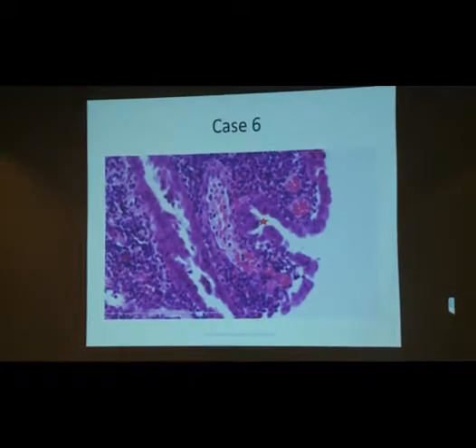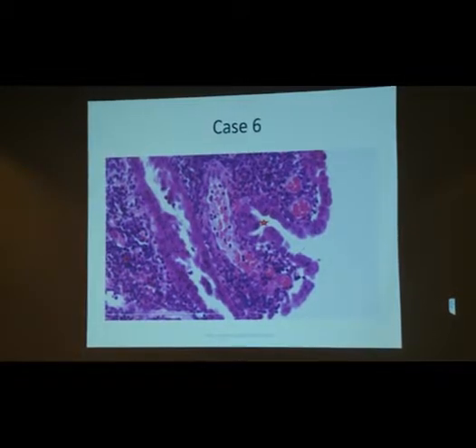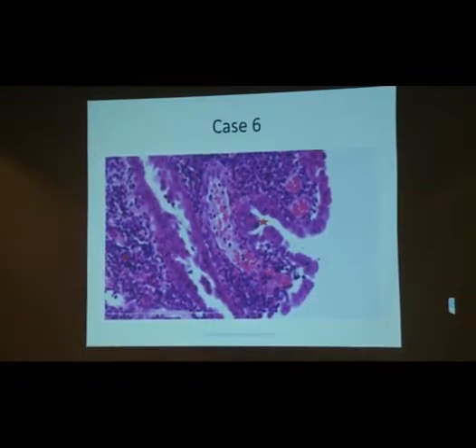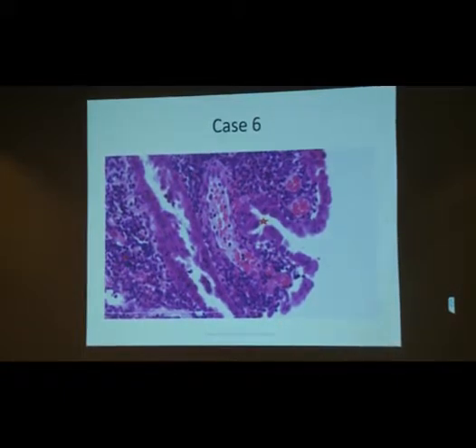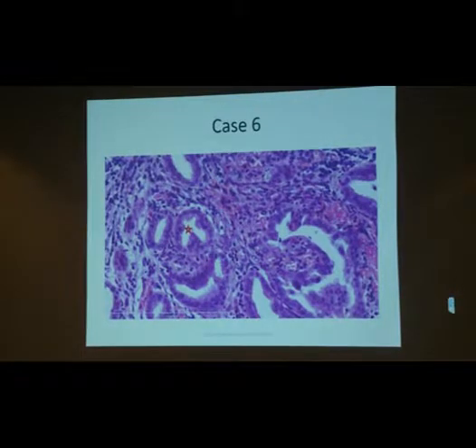Higher magnification, I've put a little red star next to some mitotic figures. And you can see at least 1, 2, and I think over here, another mitotic figure. So this is obviously mitotically active, and next to the star there seems to be a little bit of nuclear enlargement as well, so rather heterogeneous nuclei. Again here, just to show you the epithelium, another star next to this mitosis. Any thoughts? Anyone got any thoughts on this one?